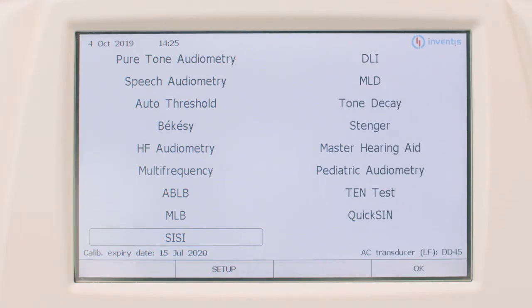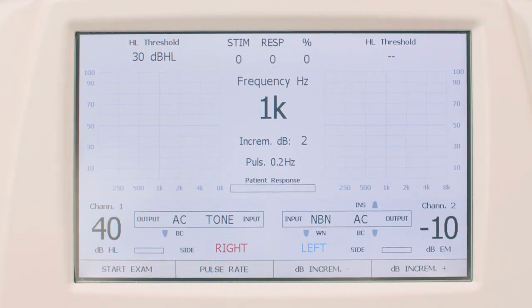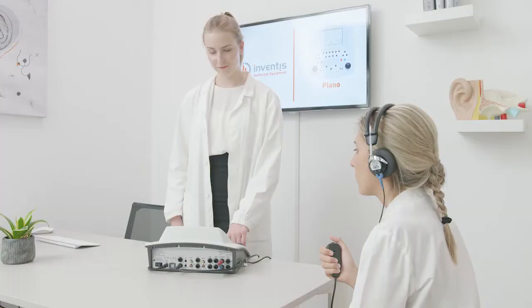The short increment sensitivity index test, also known as SI-SI, assesses the ability to identify brief variations of intensity within a continuous pure tone. To perform the SI-SI test, the operator must first bring up the relative window from the main menu. The test is an automatic procedure and is conducted by presenting a tone at different frequencies with an intensity 20 decibels above the hearing threshold.